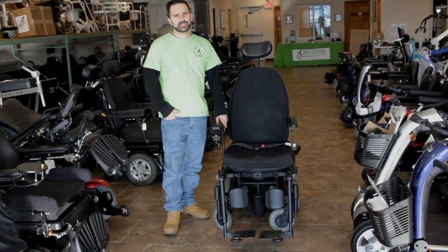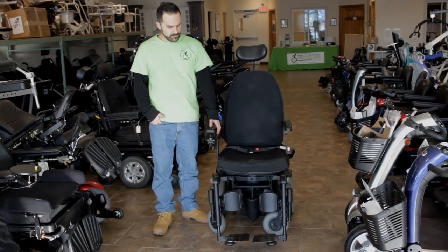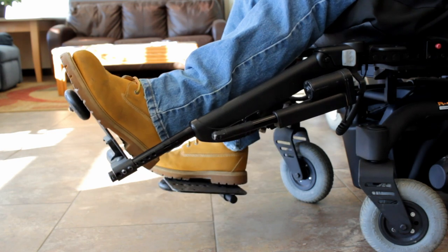What makes these power leg rests a little bit different than most is that you can actually elevate them individually. So if you just needed to elevate one of your legs, you have the ability to do that.